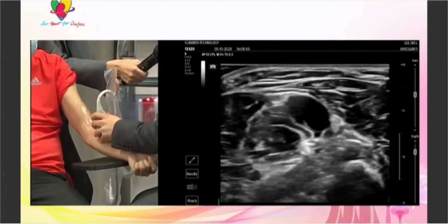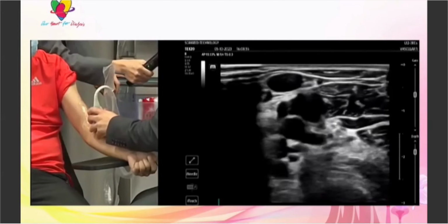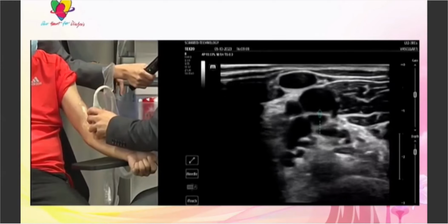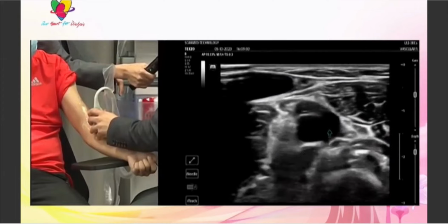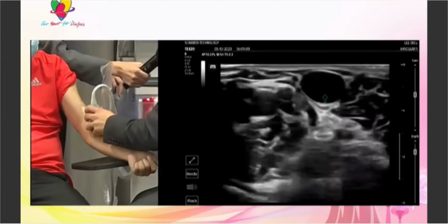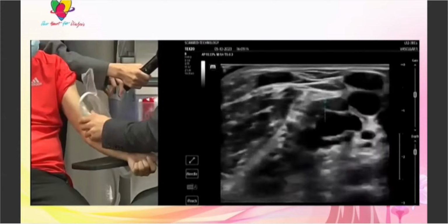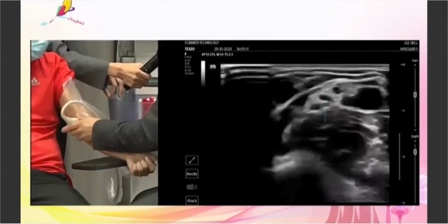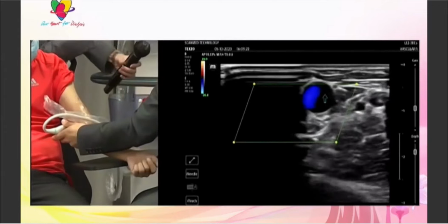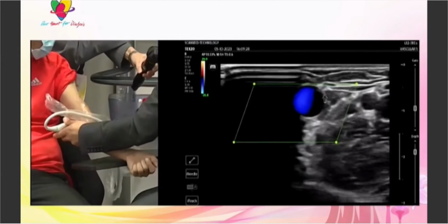So again, anastomosis, radial vein, the slight narrowing in the radial vein, perforator vein, the big perforator vein, some ulnar perforator bridge here, which we learned during the mapping. And then this goes up into the cephalic. And then I think I saw the bridge to the basilic there. So what I would do, I would measure the diameter and then activate the color just to see how the distribution of the flow is.